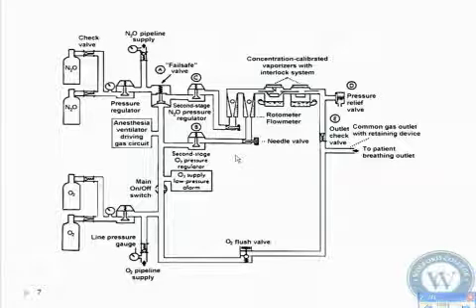Okay, so now we come along. As I said, this pressure regulator here, this is pressure regulator number 1 for nitrous, number 2 for oxygen. This thing comes in just below, just beneath your flow meters. So your flow meters, the dials that you turn on, you start the flow of oxygen and nitrous. Now, the other important thing to see here is where oxygen sits. Oxygen is always going to sit nearest the vaporizer. And why do you think that is?